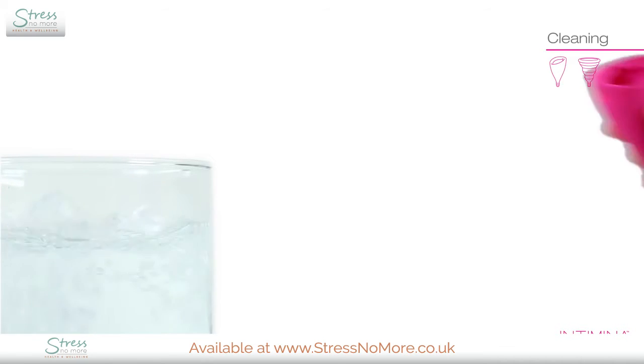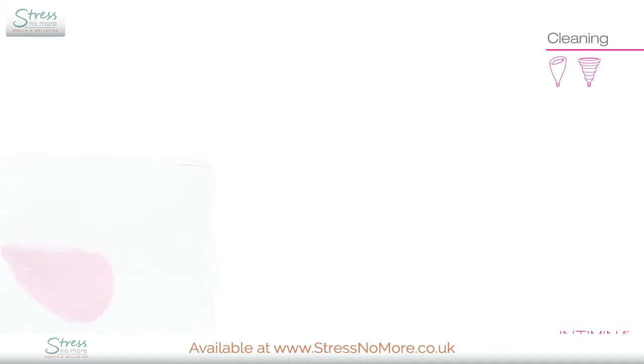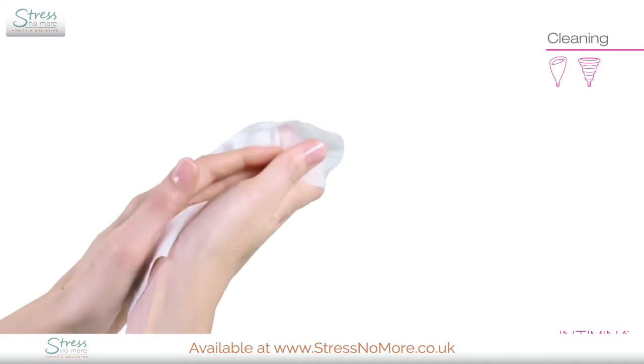Before using your cup for the first time, we recommend that you boil it for five minutes to sterilize it. For regular use, simply wash your cup with soap and water. Always remember to wash your hands as well.